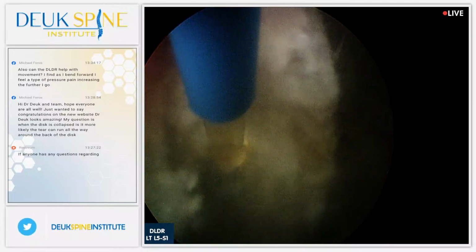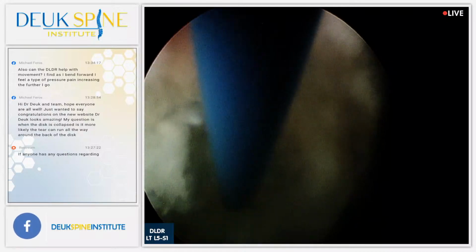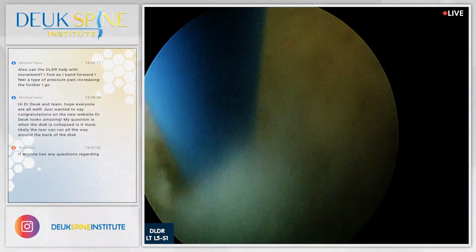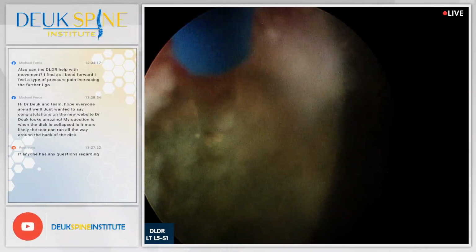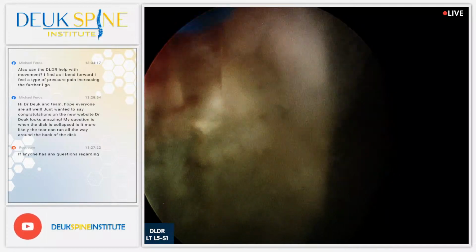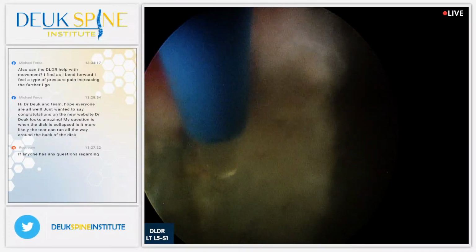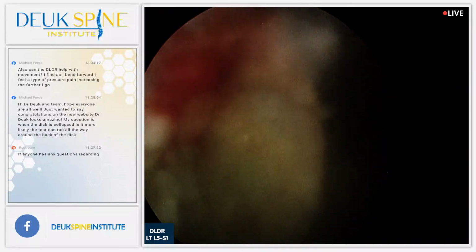All right, you can see from that animation that the facet joints in the back of the spine can also cause pain. And the way they do it is through the same process. It's called inflammation. Inflammation is your body trying to fix a problem, and it unfortunately causes sometimes more problem than it fixes. And the facet syndrome is an example of that. Just about done. I'm just trying to clean as much of this herniation as I can with the laser. Any other questions? At this moment, no current questions.